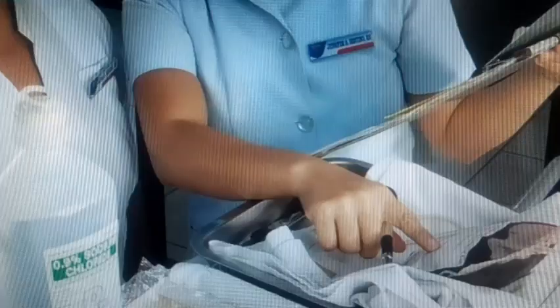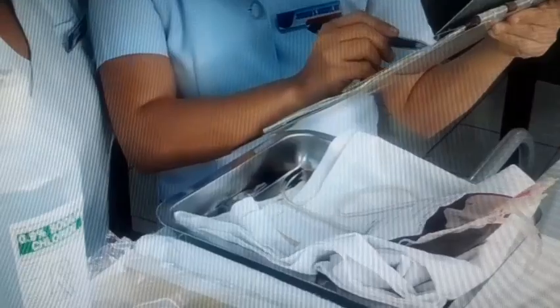Check for correct identification information. Check the client's identification band. Do not administer blood to a client without an armband. Observe the 10 Rs when preparing and administering a blood transfusion.